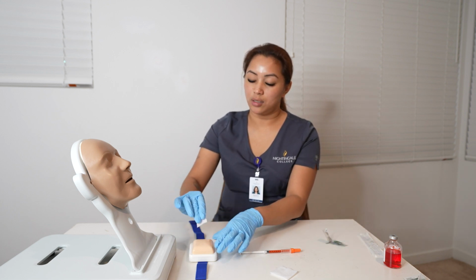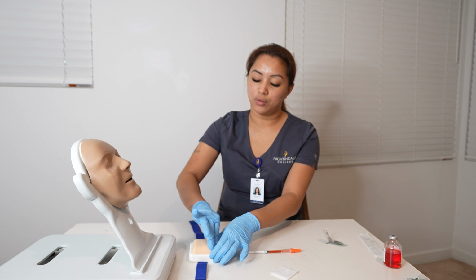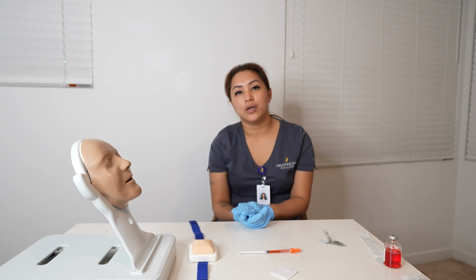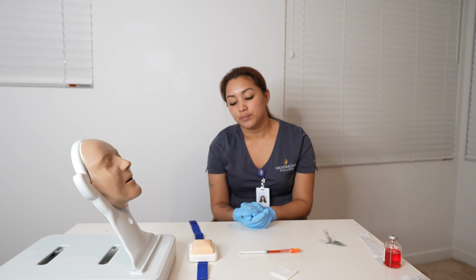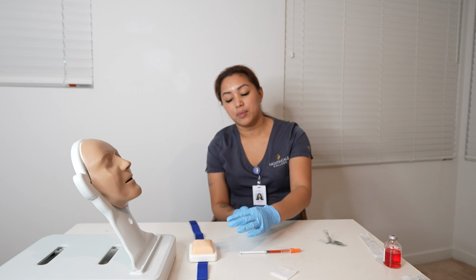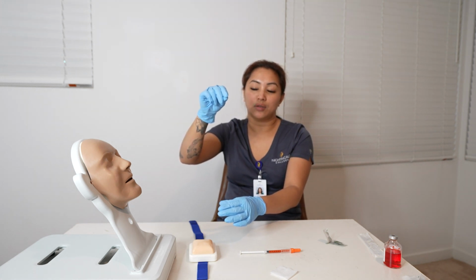Now I am going to clean the injection site. I'm going to clean inner to outer in a circular motion, 2 inches away. All right, perfect. Now I'm going to throw that away. While that is air drying, when I inject the subcutaneous injection, the heparin, I'm going to grasp the belly and then hold the syringe at a 45 to 90-degree angle.